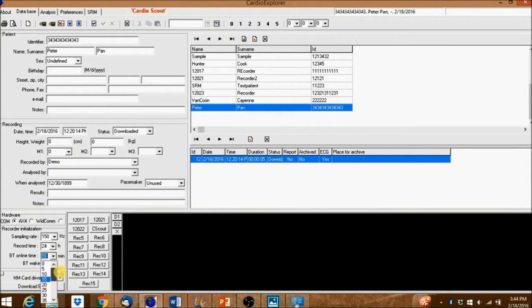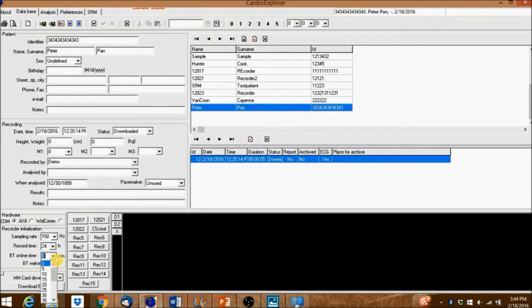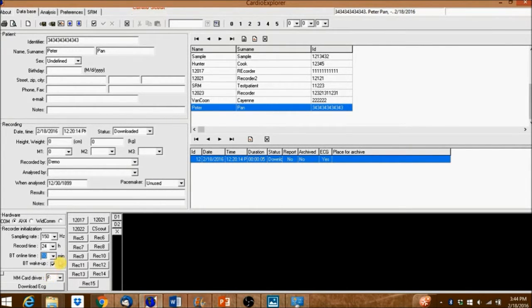Setting it to 0 minutes will allow telemetry users to see the live stream continuously. If you're programming the recorder for a Holter, we suggest setting the Bluetooth online time to 10 minutes.